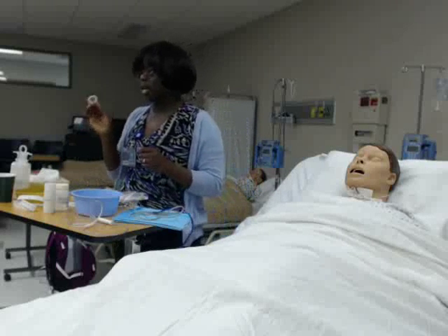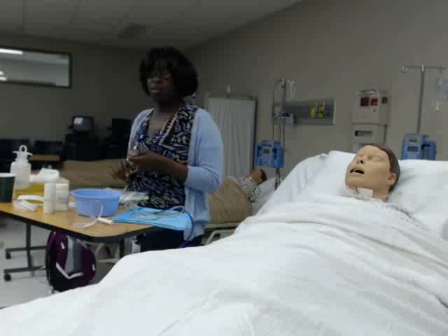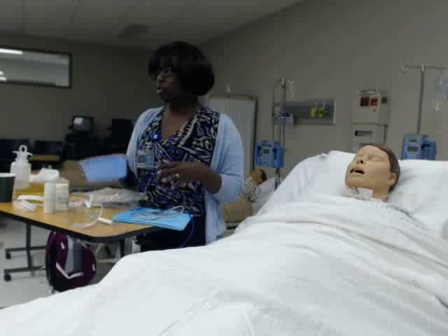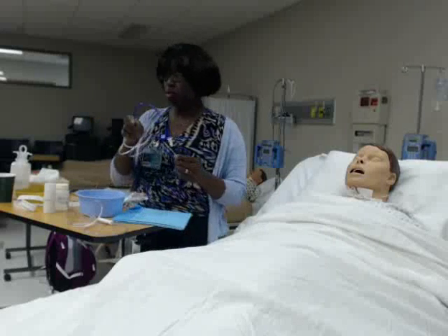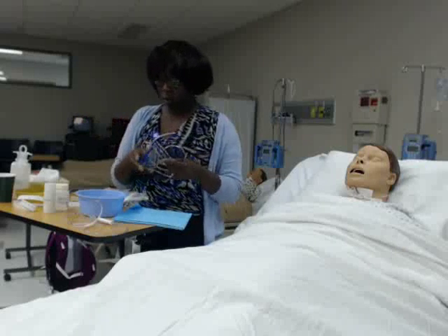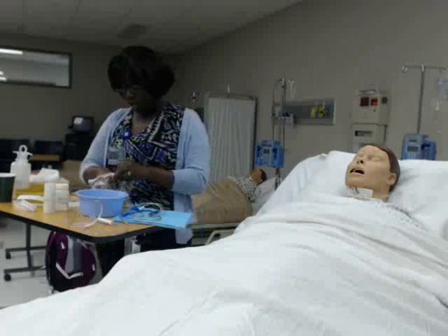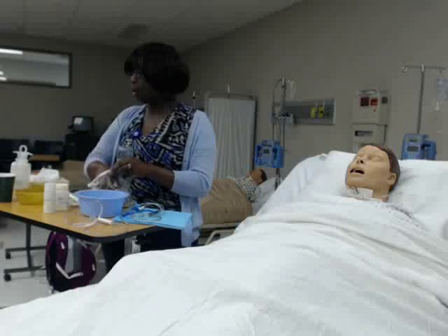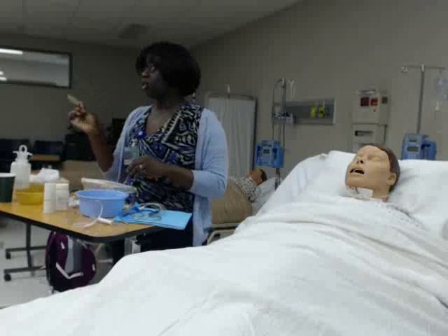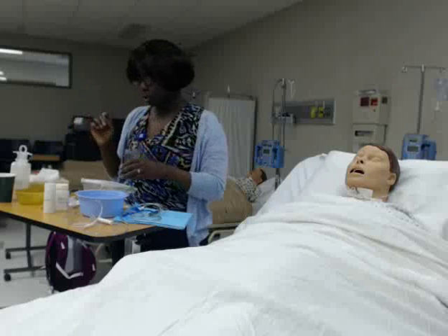We also need tape. Instead of water-soluble lubricant, you can also soak your tubing in lukewarm water to lubricate it before insertion — either works. We're going to do the lubricant today. I also want a measurement tape to see how far to go in, and a tongue blade to make sure the tubing is going where it's supposed to and not coiling in the mouth.